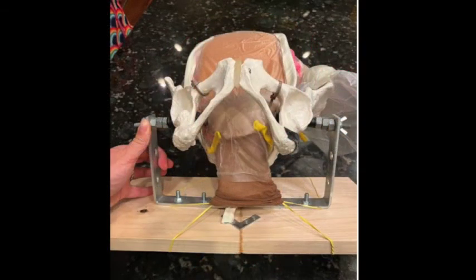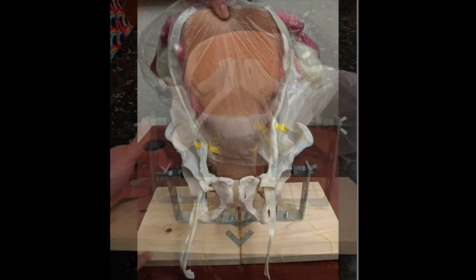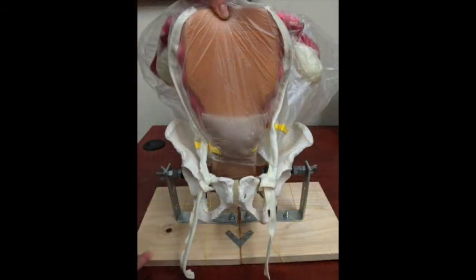Components adding to the realistic feel, such as the large balloons with water that simulate bleeding if not appropriately ligated, emulate the status of a gravid uterus and its vasculature. Such additions have been well received as well.